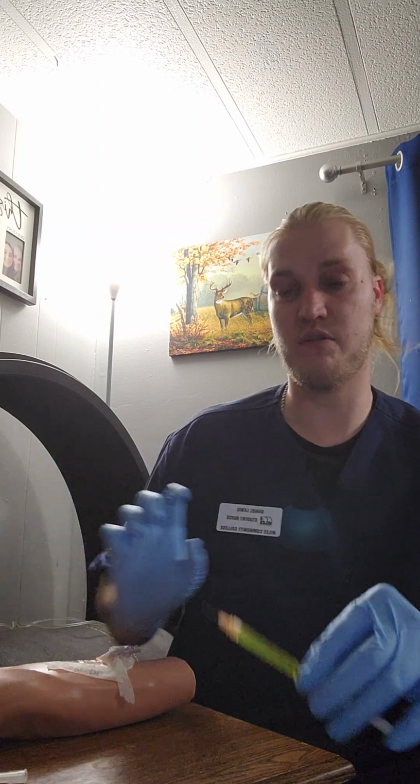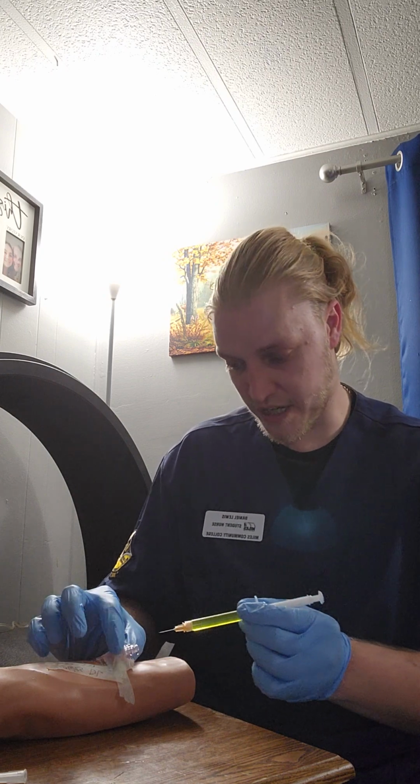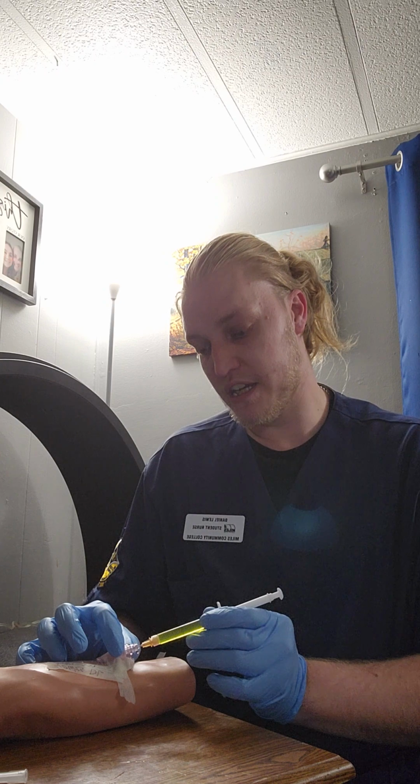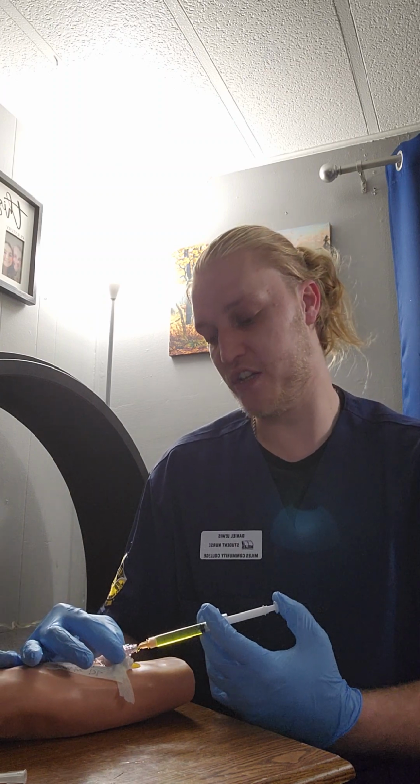Now that I have that flushed, I'm going to go ahead here again. I have a 3 ml 20 gauge needle, and I am going to stick this in the port, and again I'm going to be administering it at 1 milligram per 2 minutes. Now I'm not actually going to do it that slow, but that's how slow I would be doing it if I was doing it to an actual patient.